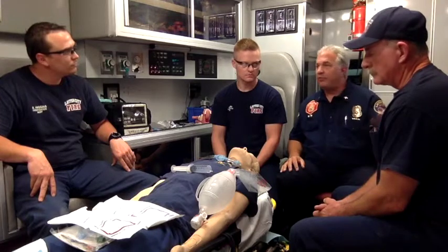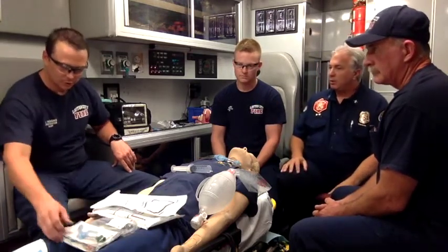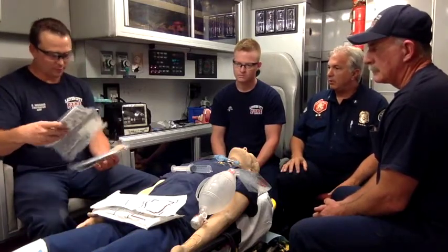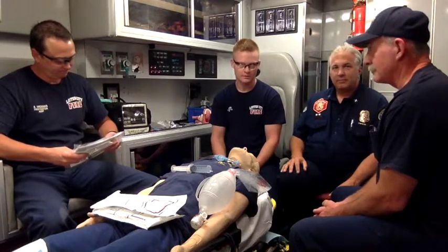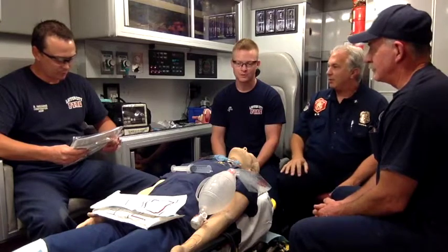Whereas if Val's got a 6-year-old granddaughter, what do you think a 6-year-old's going to be? A 6-year-old, probably one of these, a 2 or 2.5. How tall is she? Which one? Yay high. I would say probably a 2, maybe even a 3.